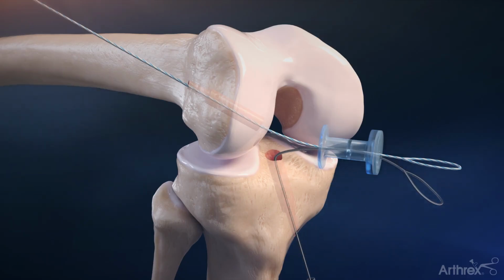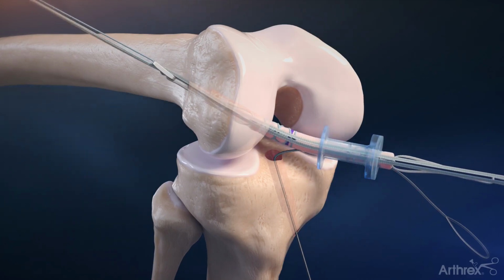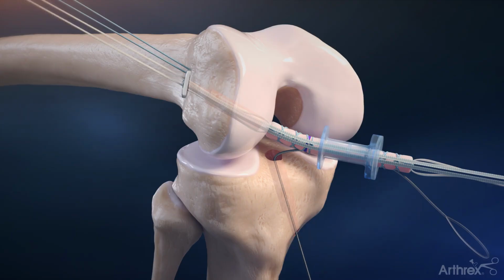With the blue and white fiber snare suture, pass the femoral side of the QuadLink construct into the femoral socket until the button flips on the femoral cortex. Use the tensioning sutures of the TightRope II implant to advance the QuadLink construct into the femoral socket.